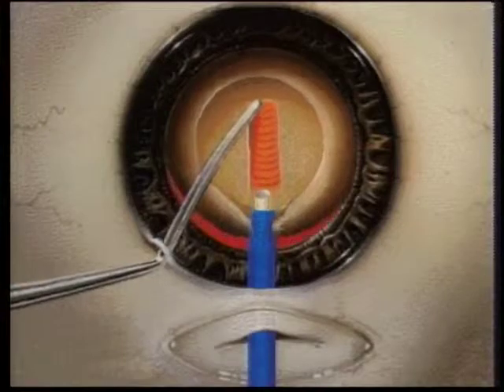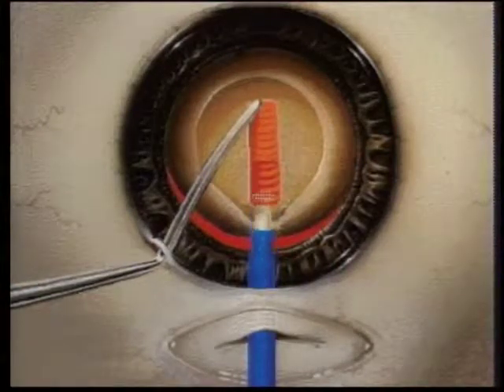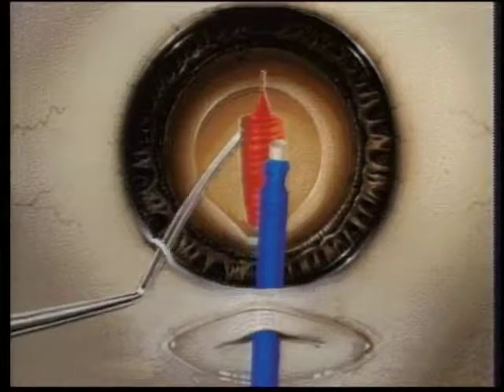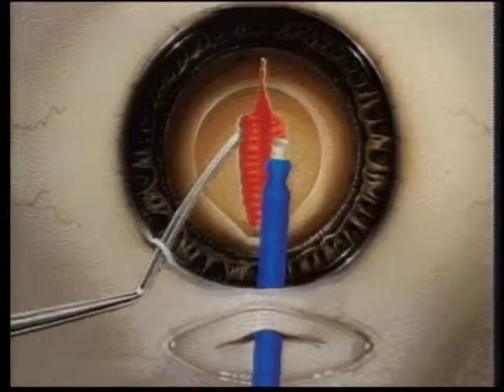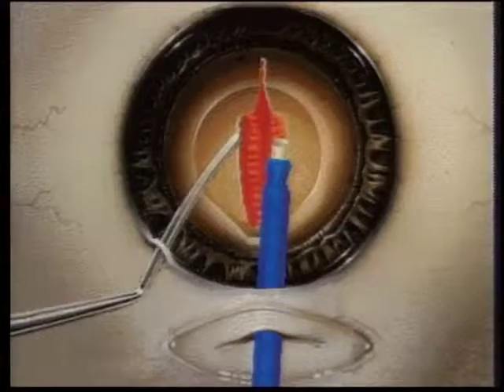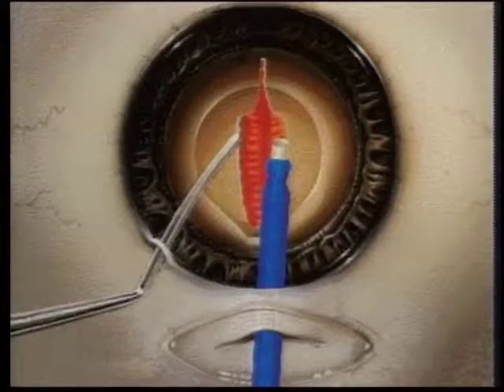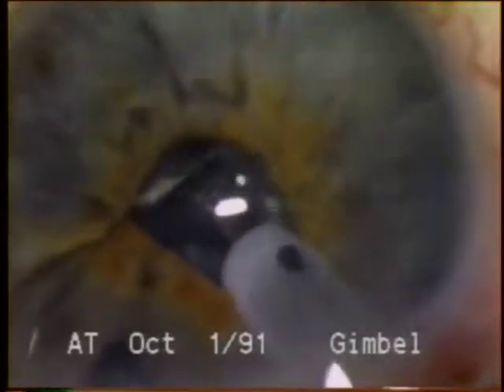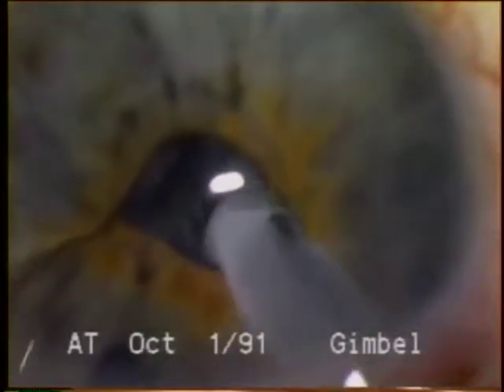This animated graphic now demonstrates the downslope technique, where after just a few passes, or even one pass, the nucleus is nudged inferiorly to emulsify the edge of the nucleus superiorly. And this very small pupil case will demonstrate how these techniques allow the phacoemulsification to be accomplished in even the very small pupils, because of the way the emulsification can be accomplished in the center of the lens.